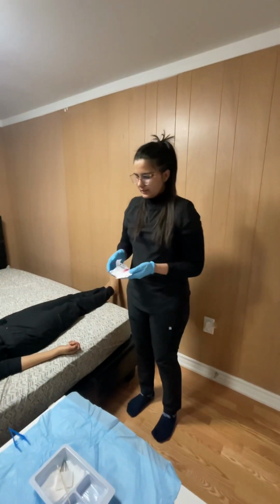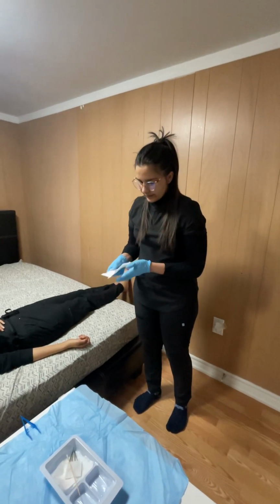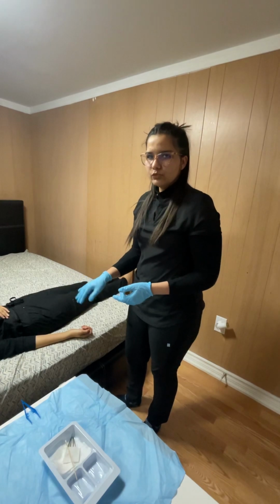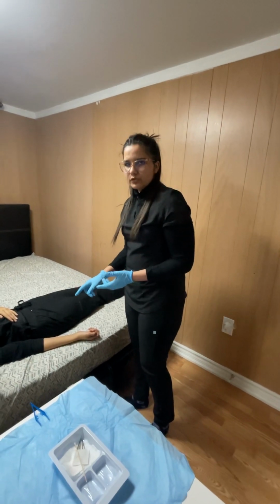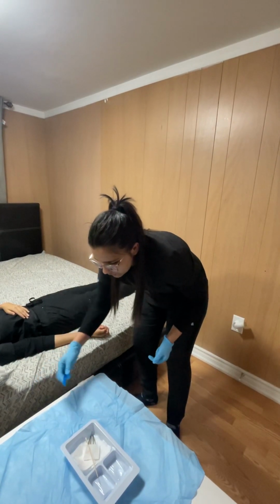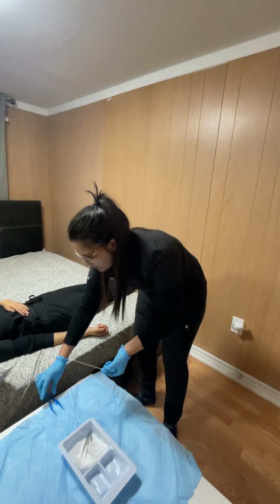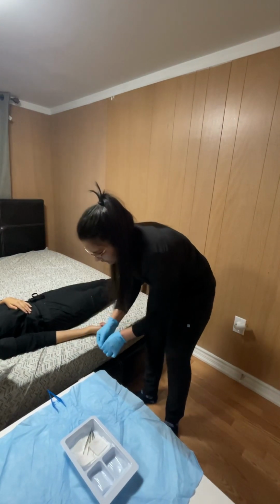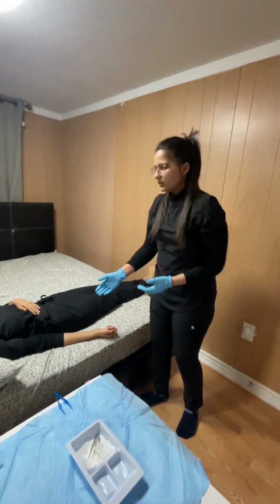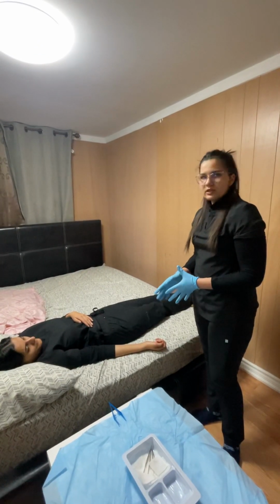On the previous dressing, we can see that there's no active bleeding or any pus, but there is a small amount of serosanguinous fluid. We'll discard it in the garbage bin. So we'll assess the wound now. The location of the wound is on the forearm on the right side, and we'll check the length of the wound with a Q-tip, measuring on a measuring tape. So discarding it off. The length of the wound is 5 centimeters, and it is well approximated, close to each other, and closed by the sutures.